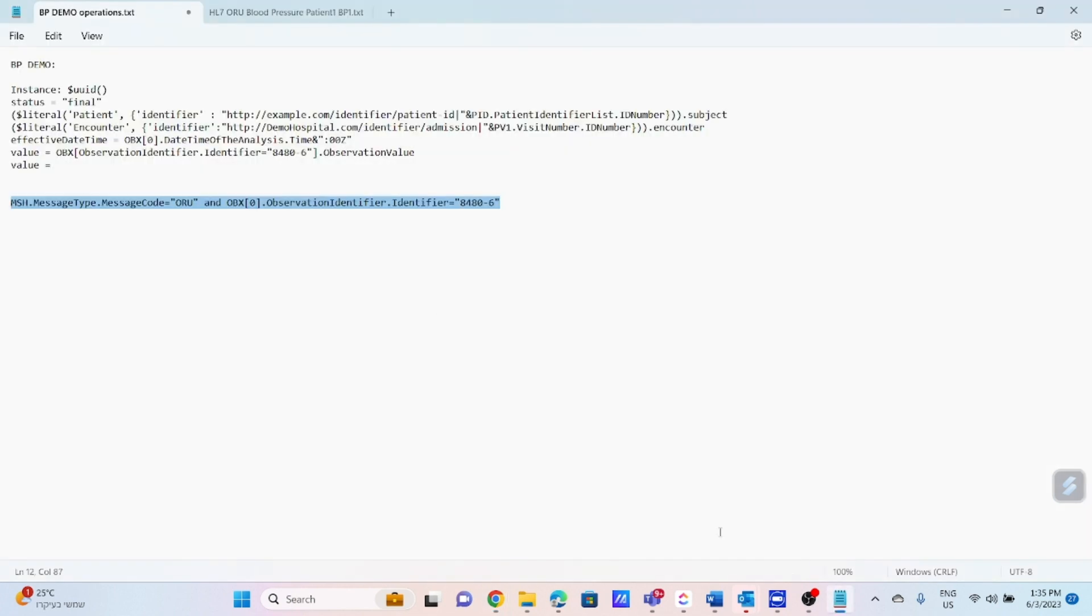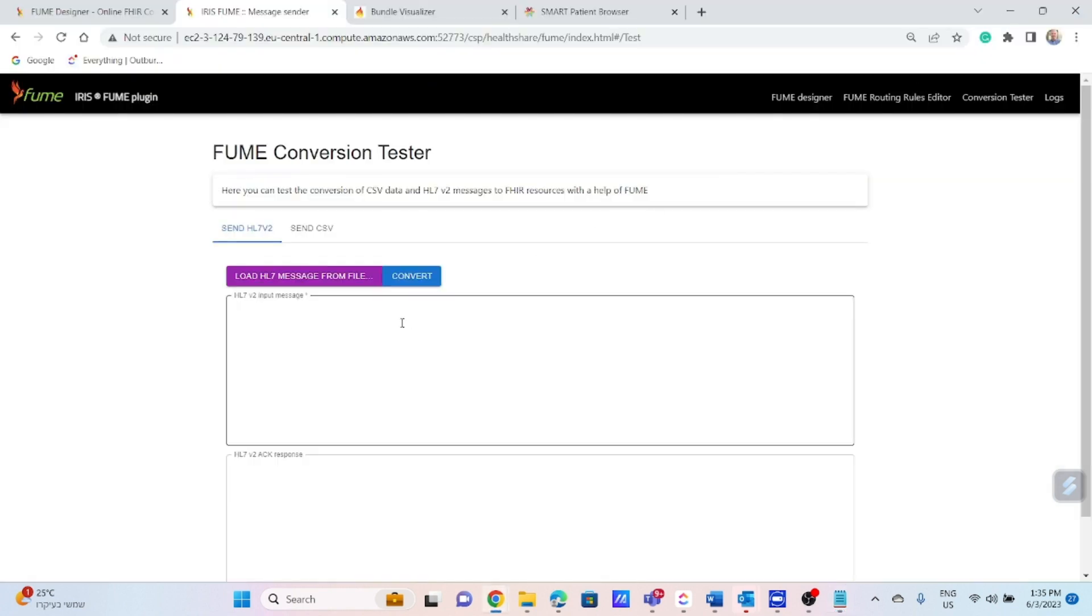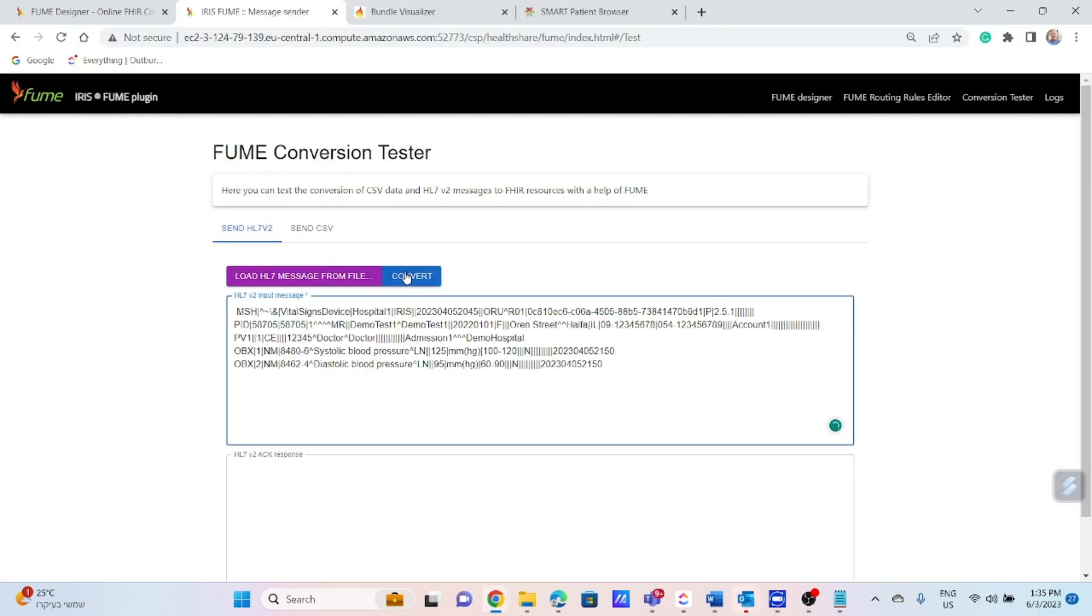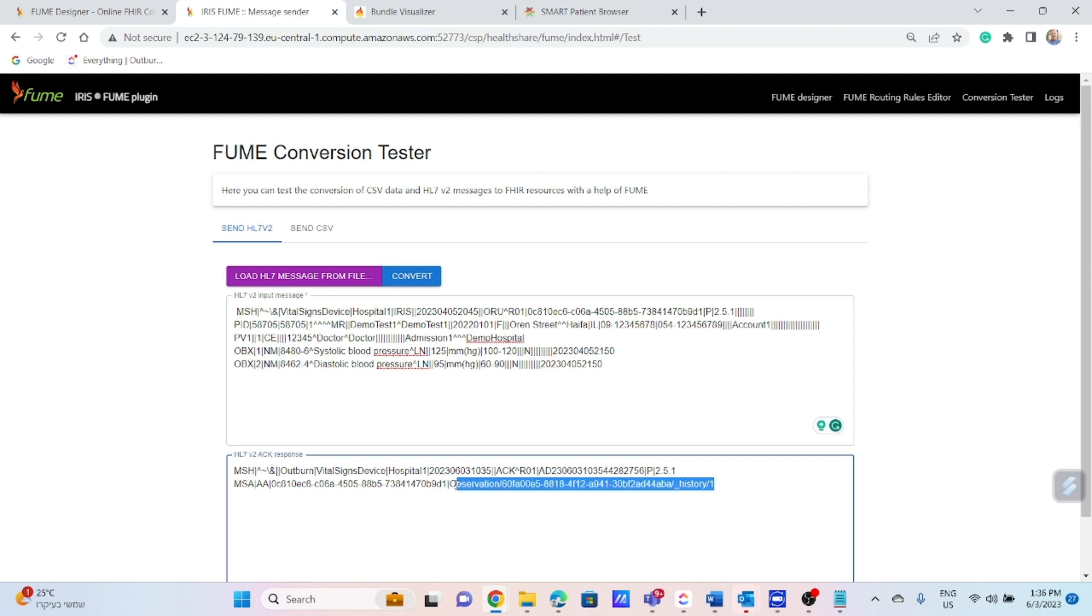Let's execute the transformation. I will take the same source message and put it here. Click on convert. We got a success acknowledgement in the bottom window. We know that the ORU message was created as an observation resource. We can see the location here to the resource stored by the server. We can basically use the get method to retrieve it.